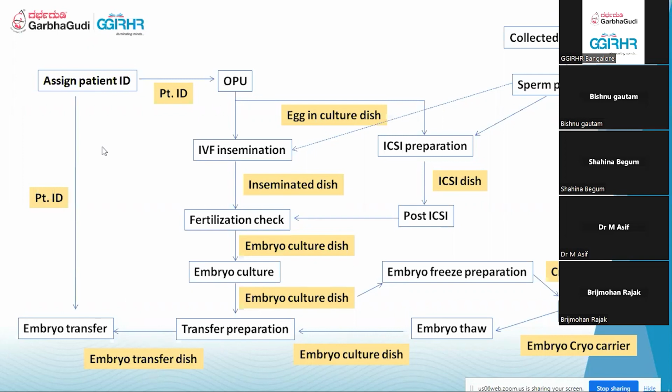So finally, the patient also will confirm here whether she has got the same embryo or not. Okay, you might have seen in the video, the patient can monitor whether she has got the same embryo or not, or whether there's any mismatch. So this is a summary which I have given. Here what I want is, this class is very simple to understand.